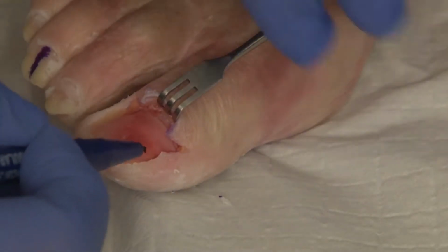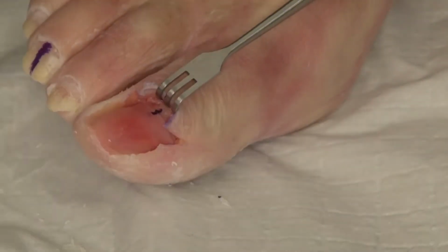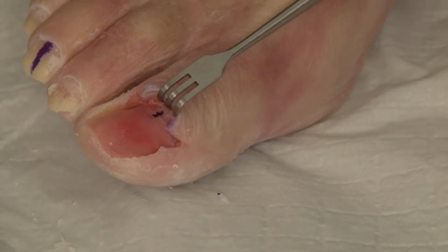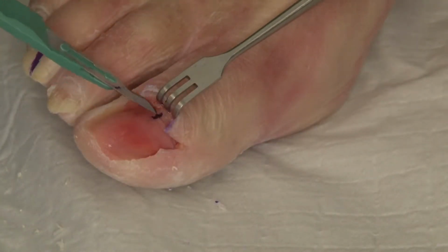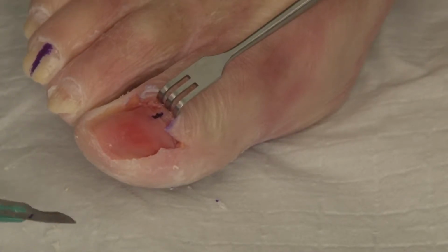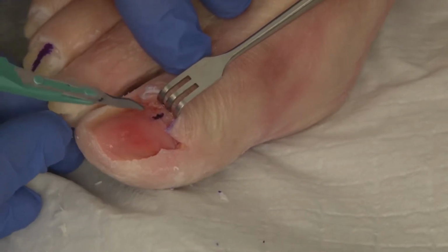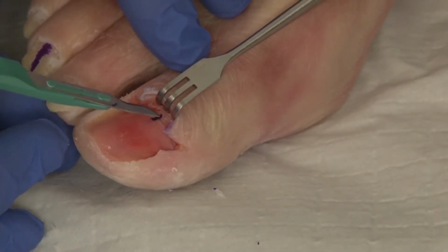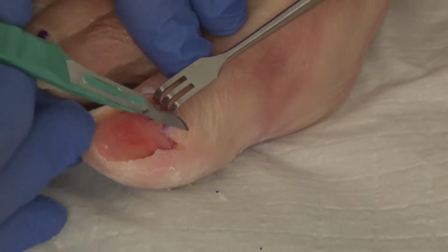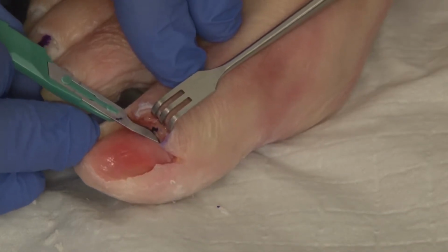So assuming that the matrix lesion is back here under the fold, as marked, we then will take a number 15 blade, and what we are going to do is a horizontal tangential shave, taking the smallest slice of matrix tissue, literally one that you could see through and even visualize the blade. The purpose of that is to avoid the dermis of the matrix as much as possible so that the matrix epithelium can regenerate itself and form new nail plate as the lesion heals. And that very simply is done by tangentially going across the lesion.